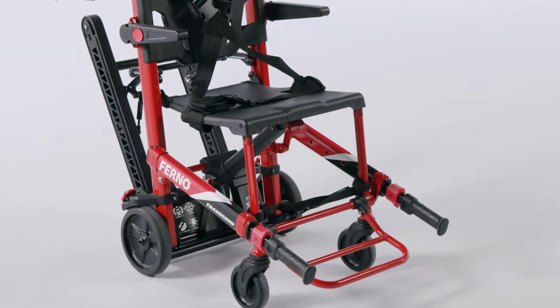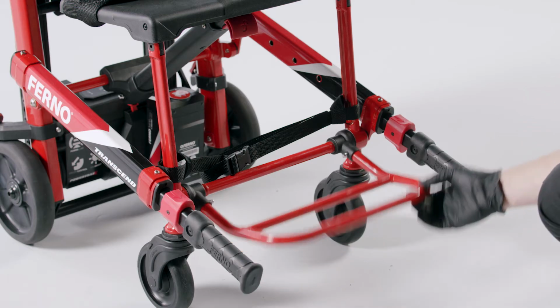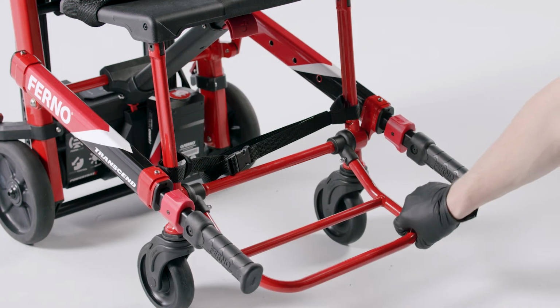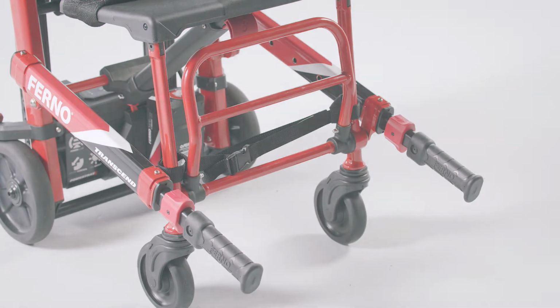The optional footrest has 2 positions: raised for storage and lowered for use. To raise or lower the footrest, swing it up or down until it stops. Raise the footrest to the storage position before transferring the patient onto or off the chair.